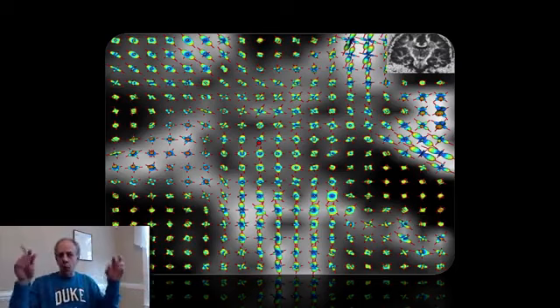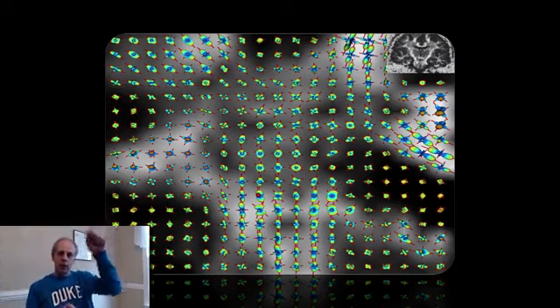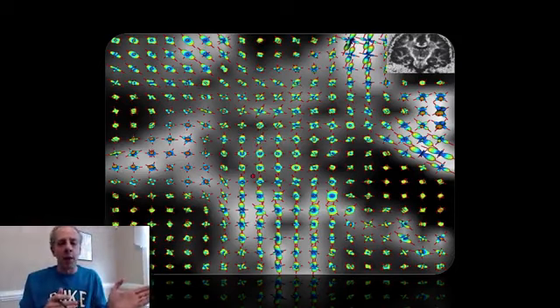I keep using the word cables because those are what connect, or give the connectivity or the conductivity between regions. So you can only pick the maxima of those and say, hey, I believe there is a connection in this direction, and maybe also in this direction, going through this voxel. So in this voxel, we might have strong connections going in two different directions.